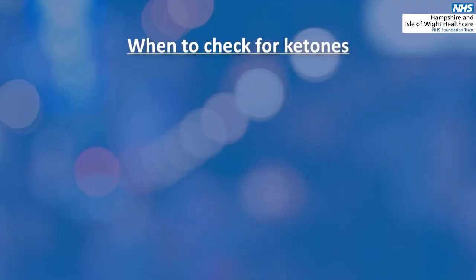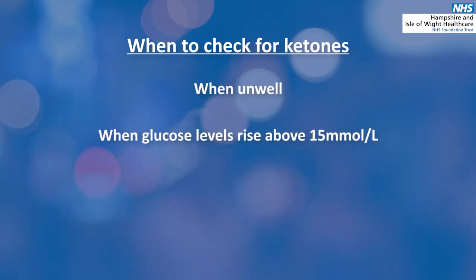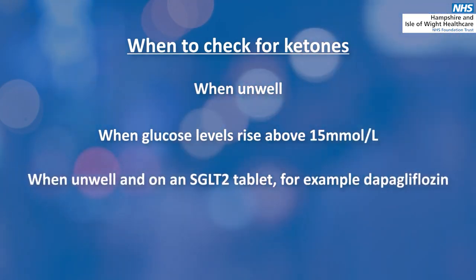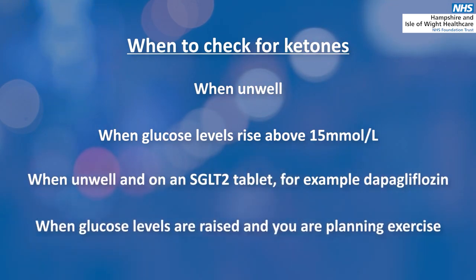So when do you check for ketones? When you're unwell, when your glucose levels rise above 15 millimoles per litre, when you're unwell and if you're on an SGLT2 tablet, for example dapagliflozin, or when glucose levels are raised and you're planning exercise.